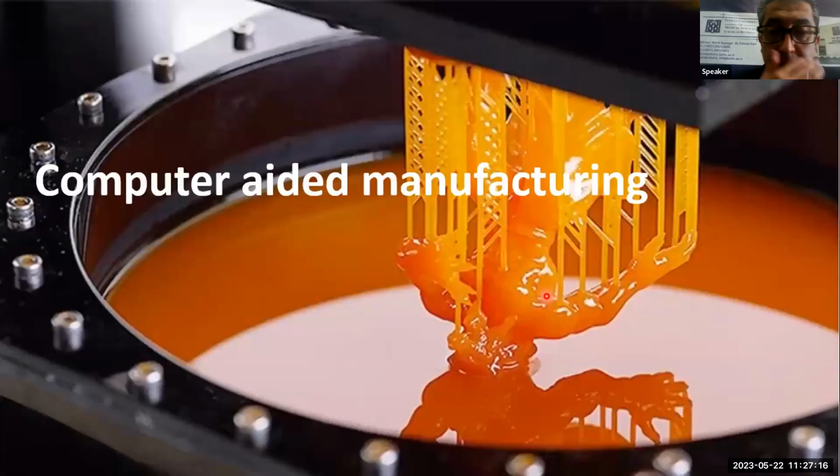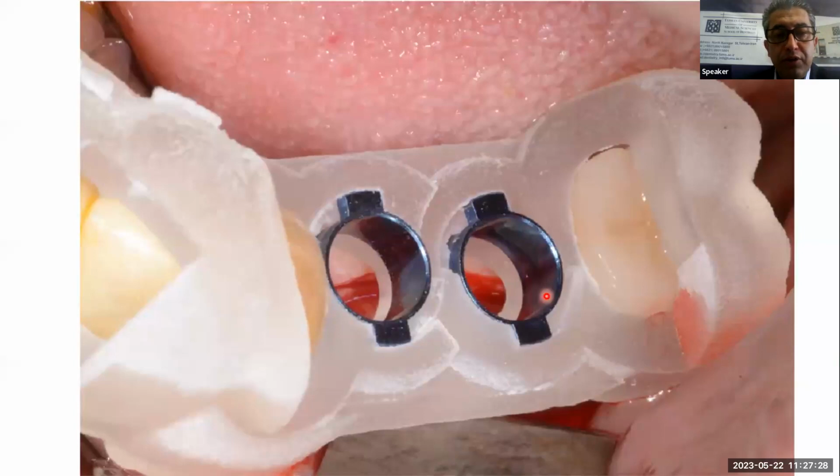Okay, in the third stage, we go to computer-aided manufacturing using different kinds of printers, as I mentioned before. Most commonly used are DLP printers. And according to the support of the implant surgical guides, we can classify them into three categories. First of them is tooth-supported surgical guides. These are very accurate and very precise surgical guides.